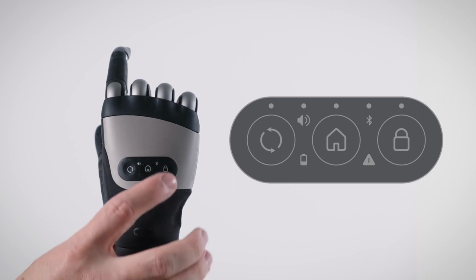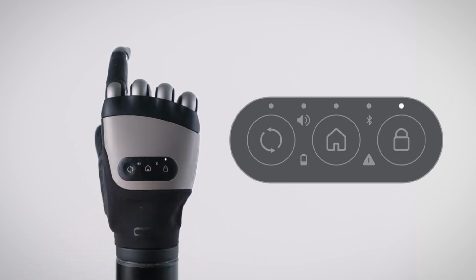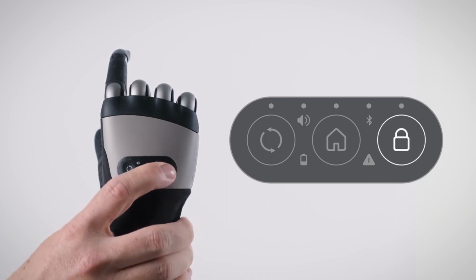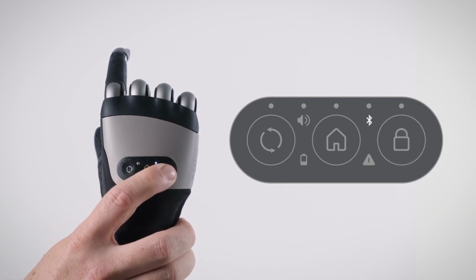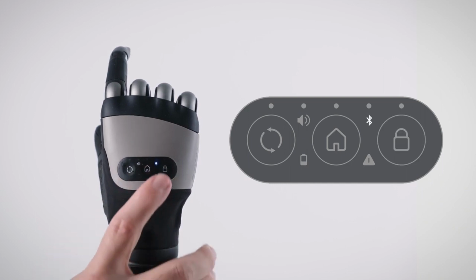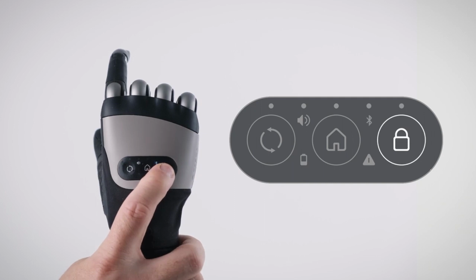A short press on the lock button will lock or unlock the hand. A long press will turn the Bluetooth on, and pressing again will turn it off. An extra long hold will activate the Bluetooth pairing mode.